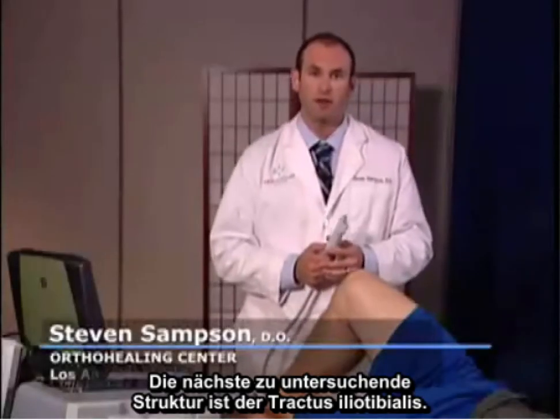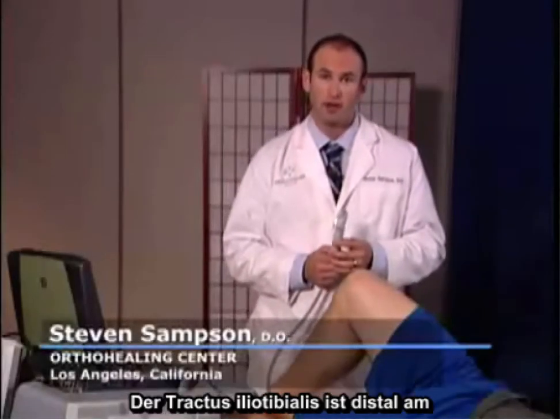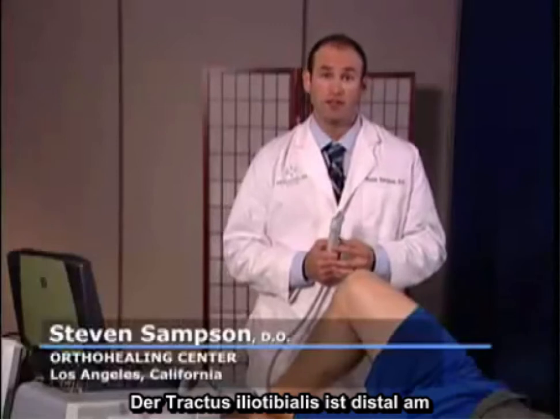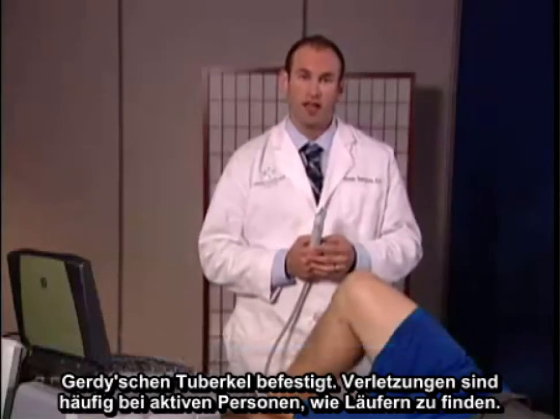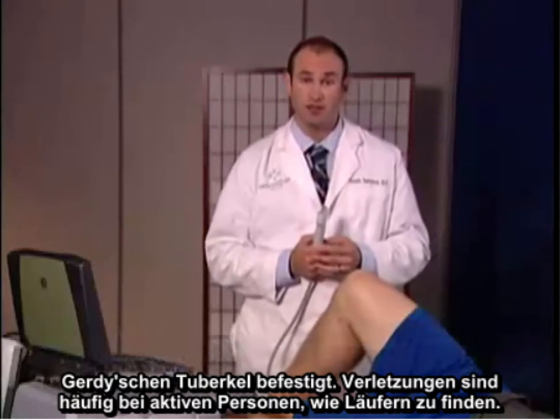The next structure to examine is the iliotibial band. The iliotibial band attaches distally at Gerdy's tubercle. This injury is commonly involved in active individuals, including runners.